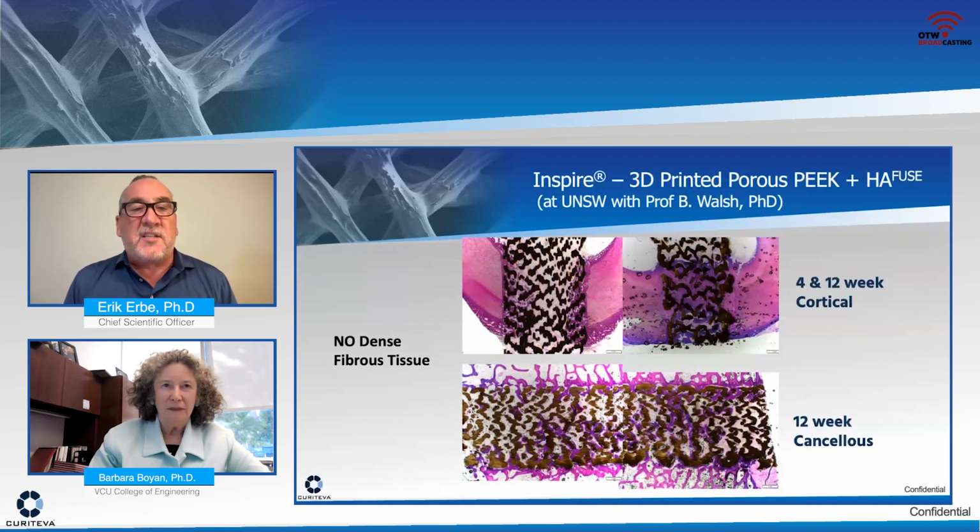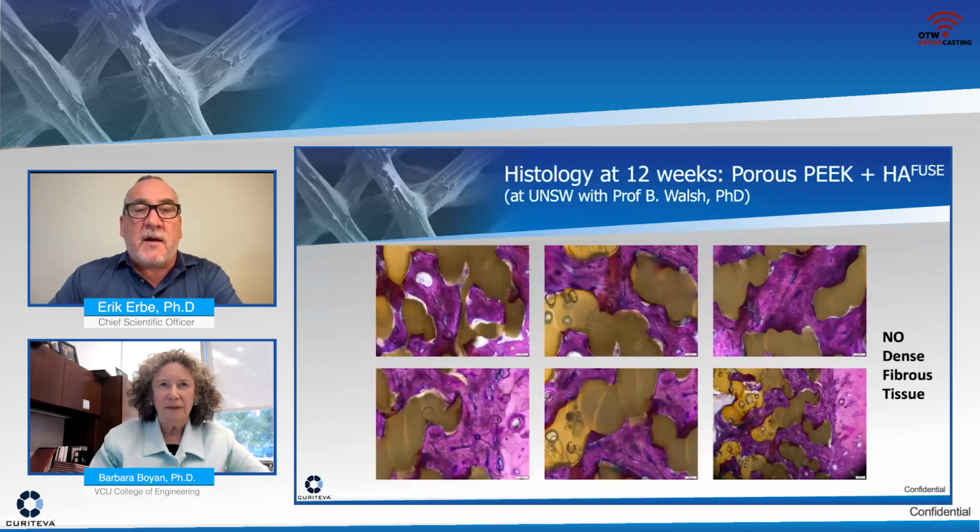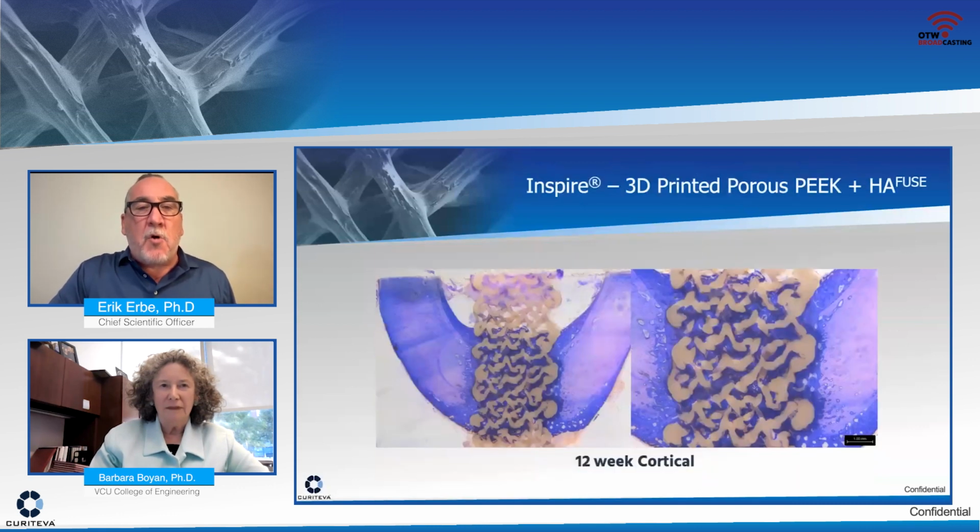What is noteworthy is the absence of any of the dense fibrous tissue that typically you might see with a PEEK implant, a blow up of that histologic interface. And what's nice, again, no dense fibrous tissue. You can see in these lower images, the native bone here. This is new bone growing in. Same down here. On the right, you can see native bone and new bone growing into that space, and filling it up quite nicely. And you get a sense of this intermingling and a biologic friendliness, not being rejected by fibrous tissue, but this bone looks indeed.